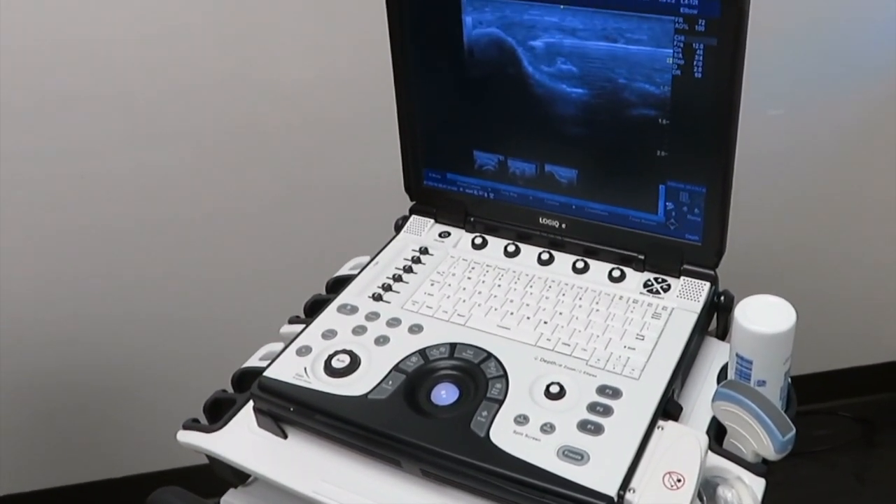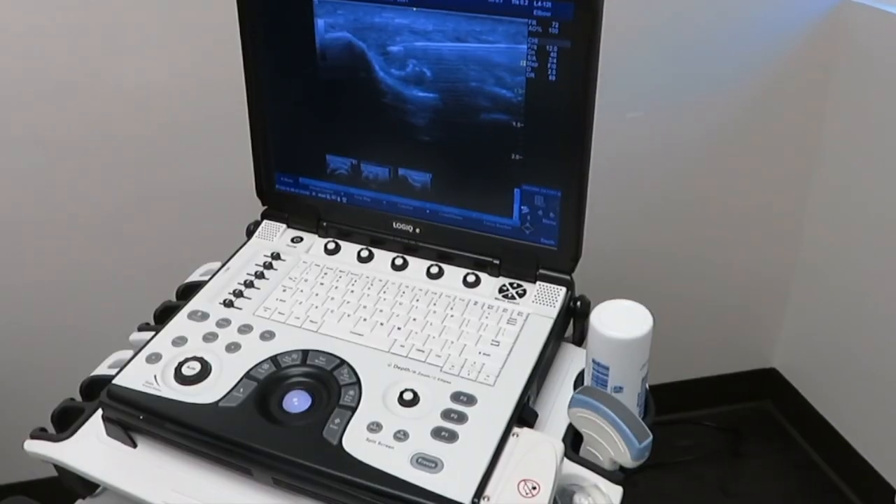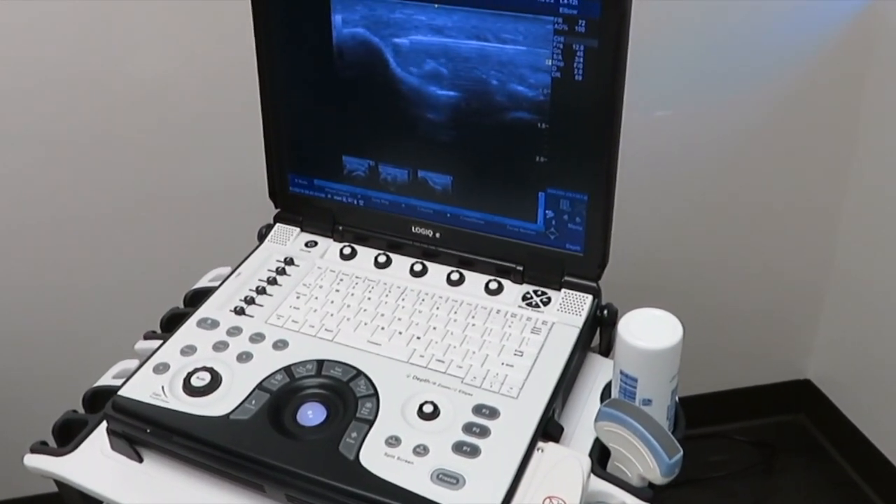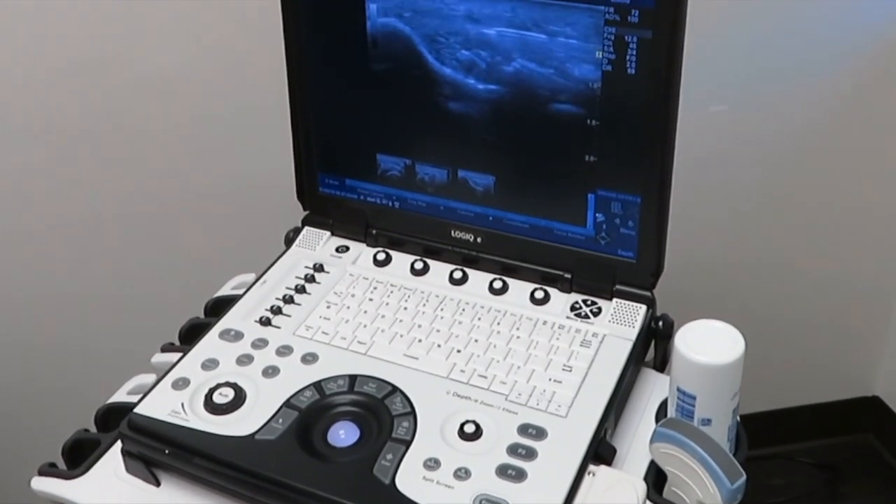How are you doing? Good. Not bad. Good — tough man. We'll drive it all the way up there and try to bathe the whole area. We're on top now.